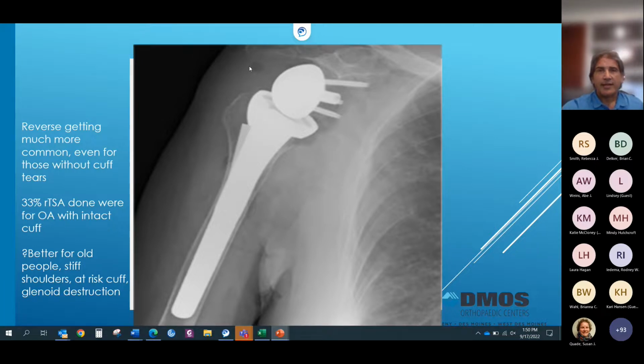There can also be some cosmetic defect here. You can imagine if you stretch that arm, you're going to make that arm a couple centimeters longer, and you can get a little dip in some designs just off the acromion process. So it can look a little funny, and I try to tell people that will happen in a lot of people, you know, if they're thin.